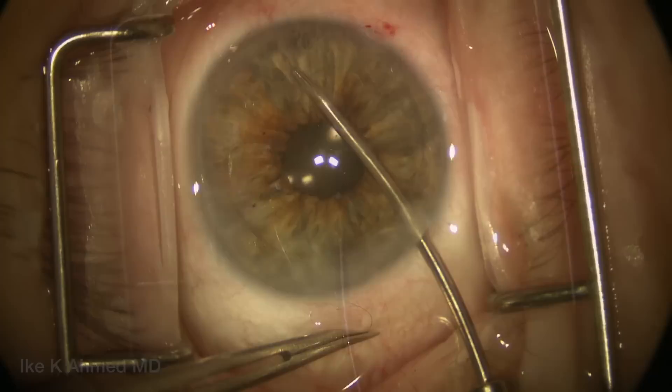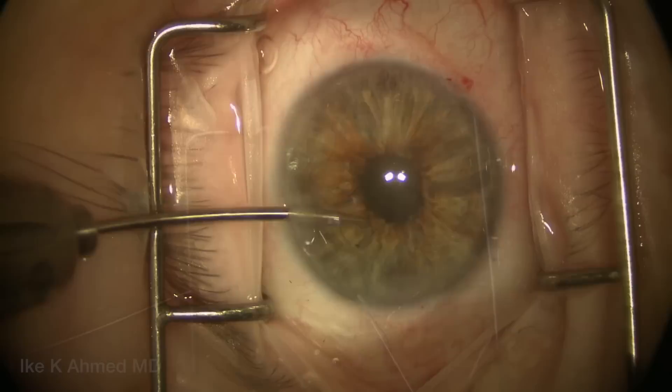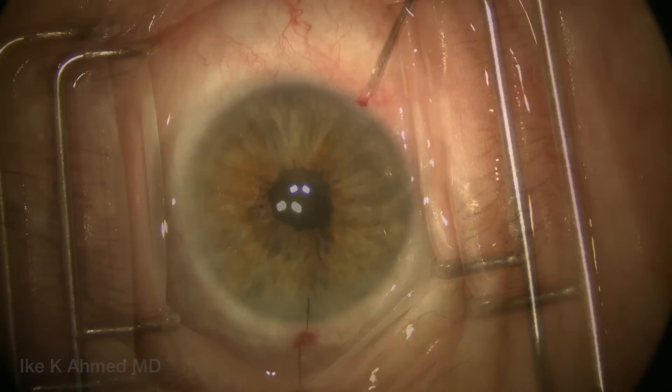The final throw is made to confirm the knot, and then micro scissors are used to trim the suture ends to adequate size. The pupil has come down quite nicely — it won't dilate more than this, but it will significantly reduce the photophobia and glare this patient has experienced, with an adequate cosmesis result in this case of traumatic subluxation of the lens and atonic pupil. Pupillary cerclage is probably one of the more complex procedures we do in the eye and can be performed under topical with intracameral lidocaine, or retrobulbar block if necessary.